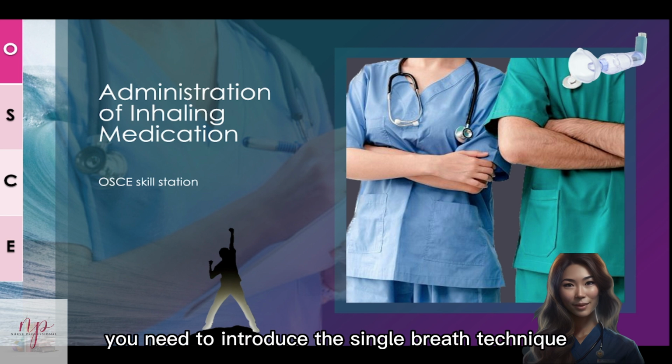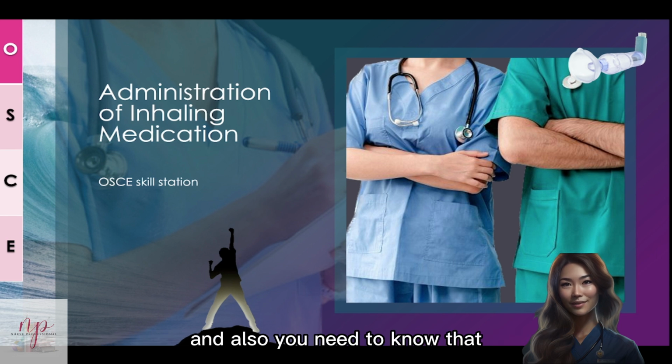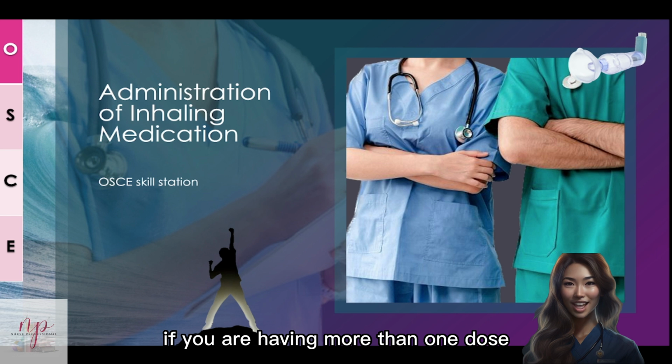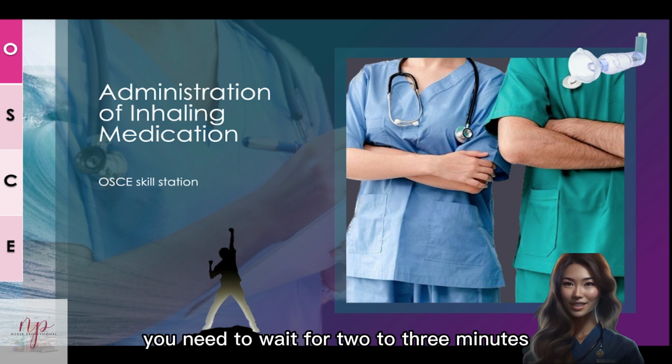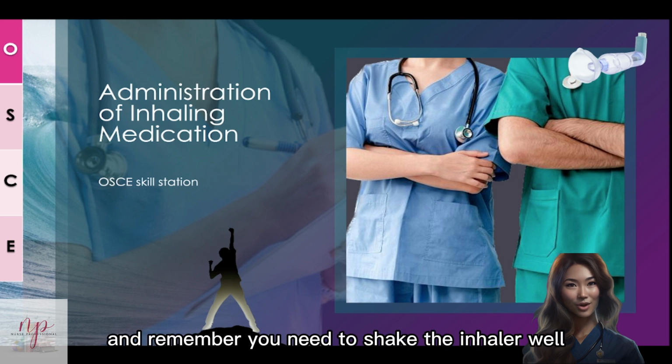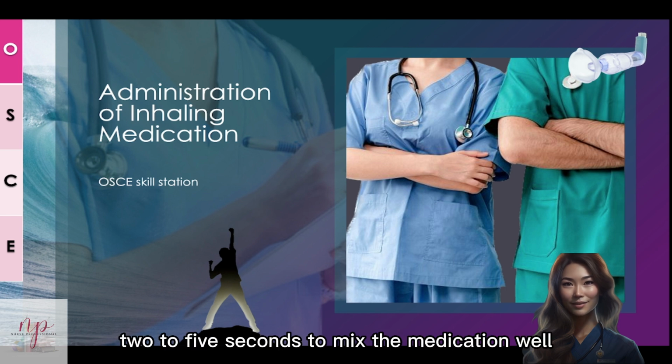Alright? And also you need to introduce the single breath technique as well as the tidal breathing technique to the patients. And also you need to state that if you are having more than one dose, you need to rest for 30 to 60 seconds before the second dose. And if you are having another inhaler, you need to wait for 2 to 3 minutes in between. And remember, you need to shake the inhaler well. Okay, shake it for 2 to 5 seconds to mix the medication well.